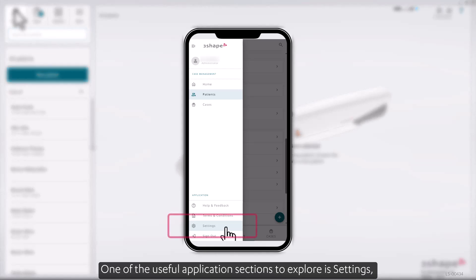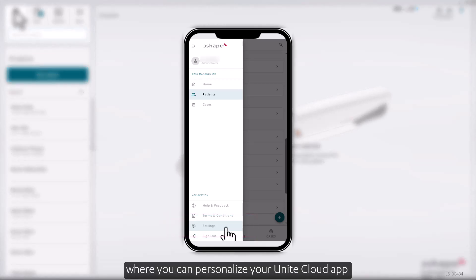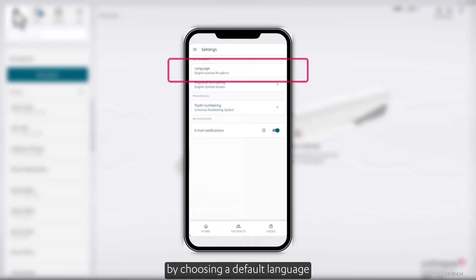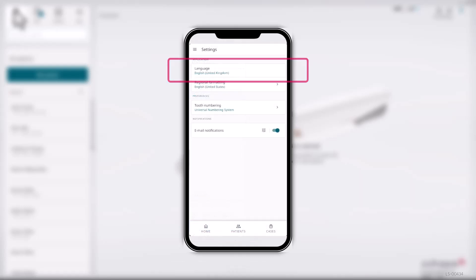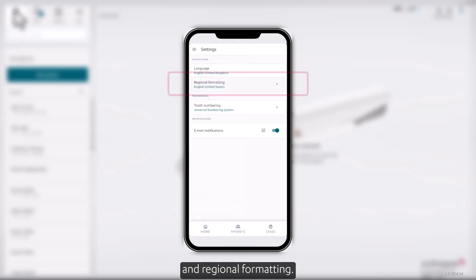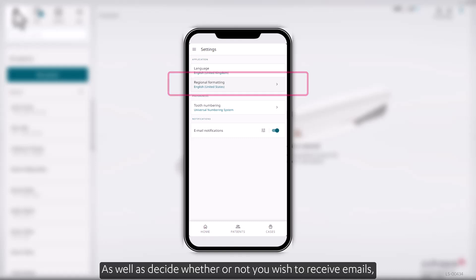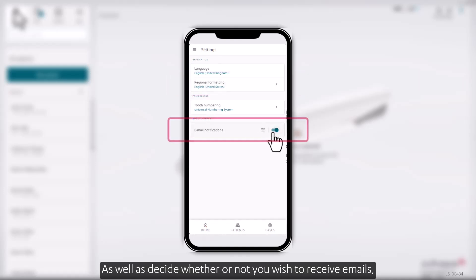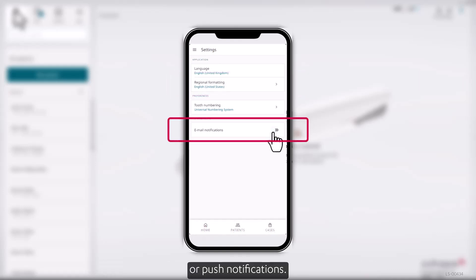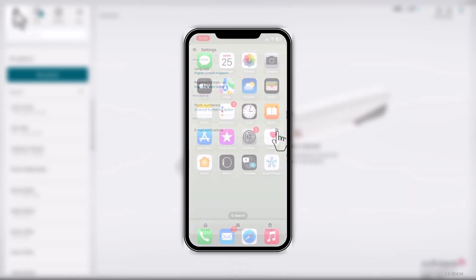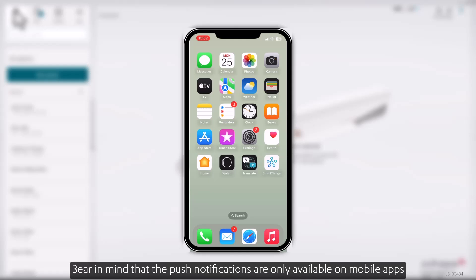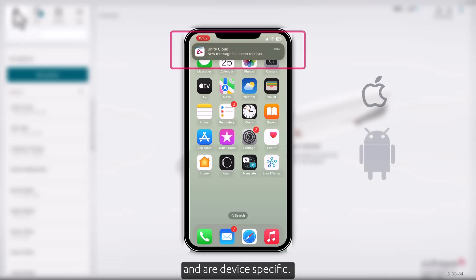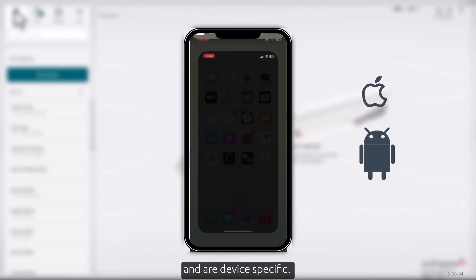One of the useful application sections to explore is Settings, where you can personalize your Unite Cloud app by choosing a default language and regional formatting, as well as decide whether or not you wish to receive emails or push notifications. Bear in mind that push notifications are only available on mobile apps and are device-specific.